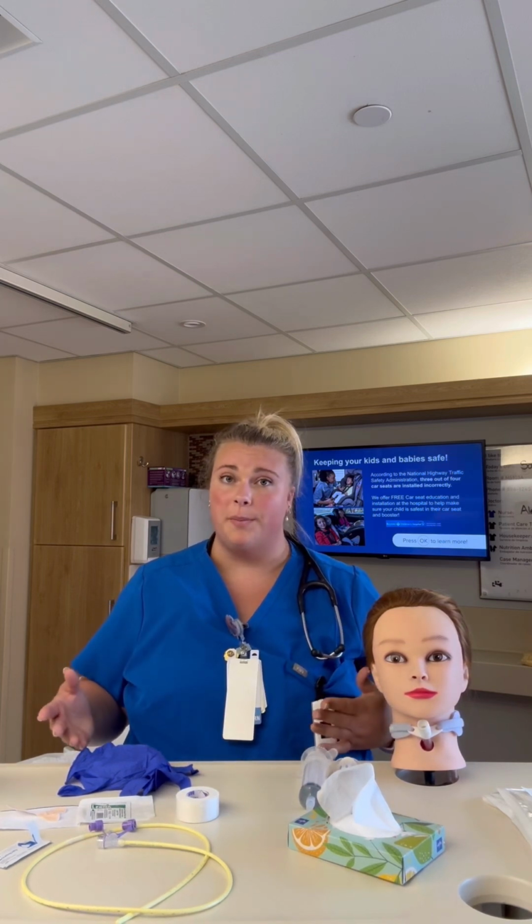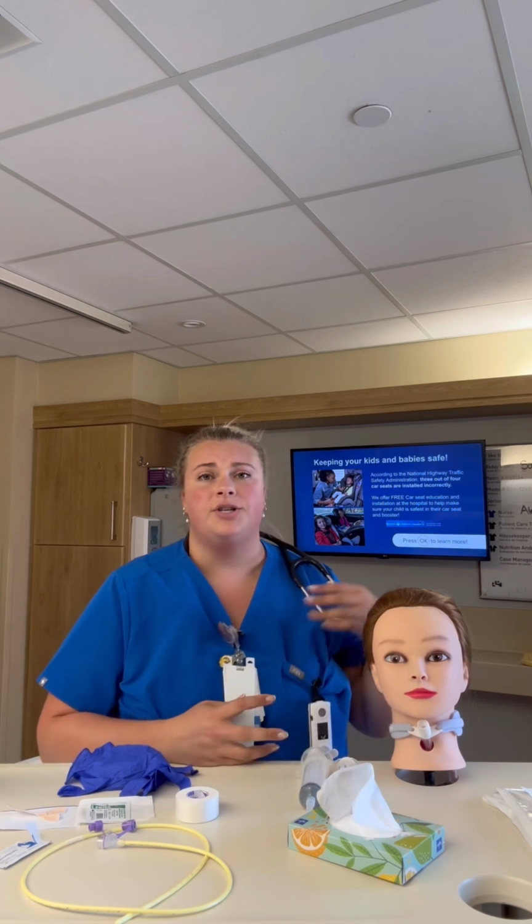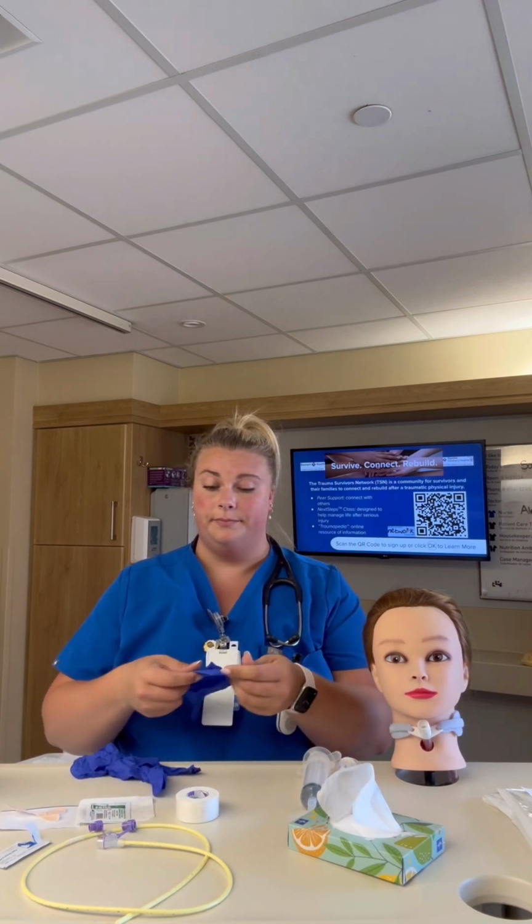We are ready to begin our NG tube insertion. So the first thing we want to do is make sure we have all of our equipment ready, including suction at the bedside. Next, we want to make sure that we're doing all of our education for our patient. We want to let them know what the procedure is and why we're doing it. Next, let's begin by washing our hands and putting on gloves.